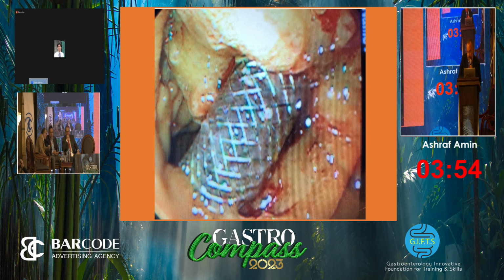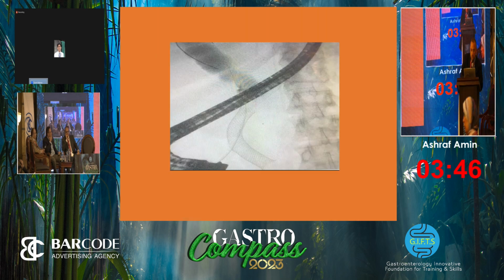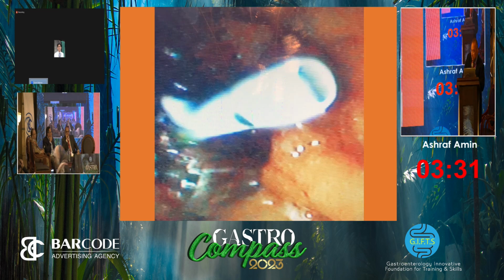So we tried first to solve the problem. This is the X-ray. The stent was migrated and impacted in the duodenal wall here. So what I did is, I cannulated through the uncovered stent and passed the guide wire. Then I inserted a plastic stent through the wire and through the metallic stent to resolve the cholangitis.